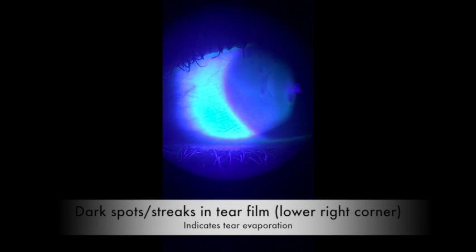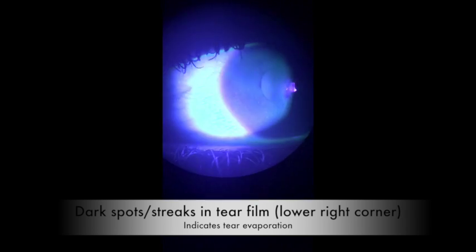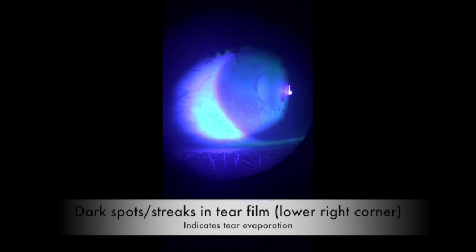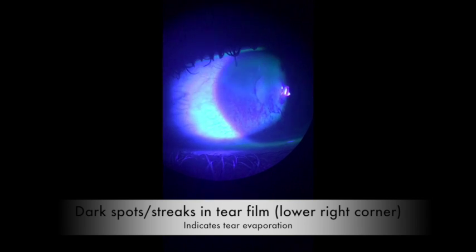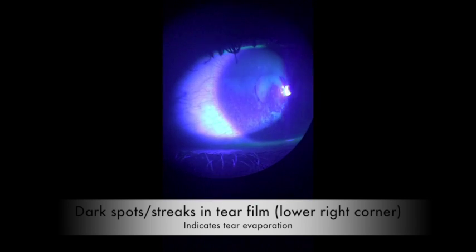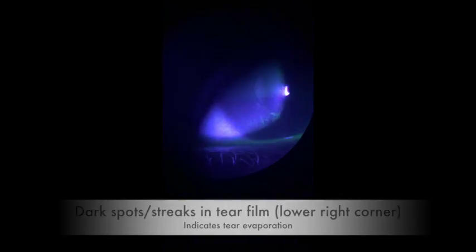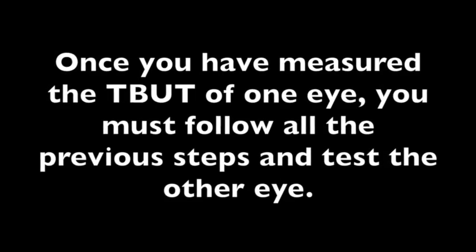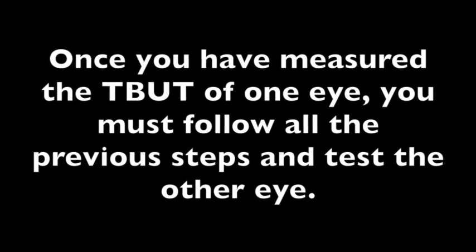It is very hard to clearly video record the dry spots on camera. However, as you can see here, dark spots and streaks have appeared in the right corner of the patient's tear film after just 4 seconds. As more seconds go by, greater evaporation of the tear film can be observed. Once you have measured the TBUT of one eye, you must follow the previous steps and test the other eye.